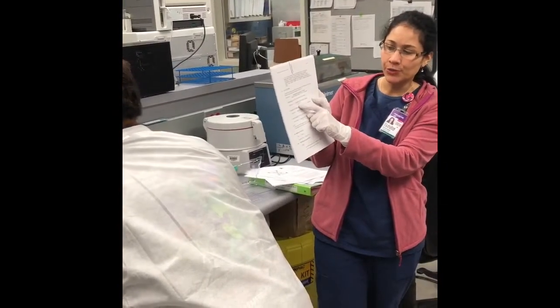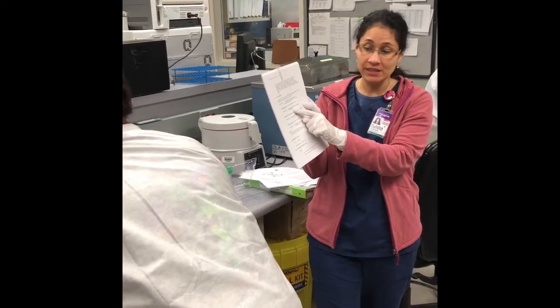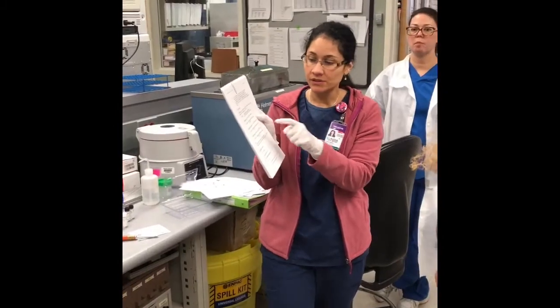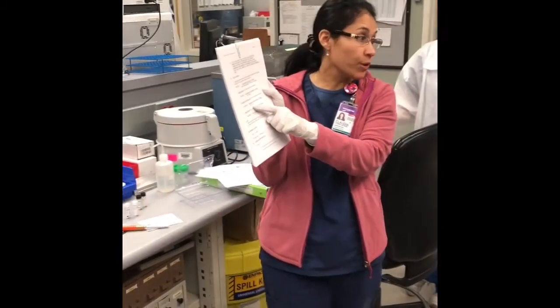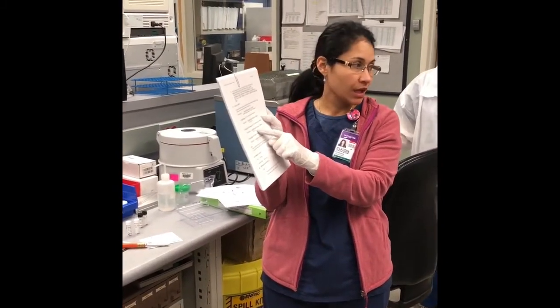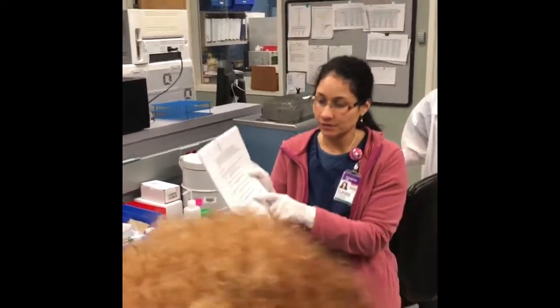A, B, C, D, E, so the small squares, and then you will notice that it will be 10 multiplied by 0.04, that's the dimensions of that specific square. It's kind of different if you're running nucleated cells, you see 0.1, so the square is a little bigger than the other ones. So you already have a dilution on there too? Yes.